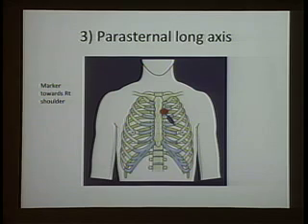So we're trying to standardize how the views are presented. We don't want to have the heart in all kinds of positions. Everybody does what they want. So we standardize that so we can have an image that we can recognize.